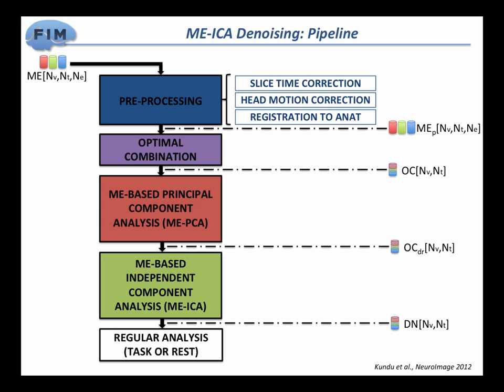And then at the end of the whole thing, it will throw you a series of files, and I will mention some of the most important ones, that you can then take as the input to your statistical analysis. So think of it as a different way of doing your pre-processing, or as an extra step in your pre-processing.